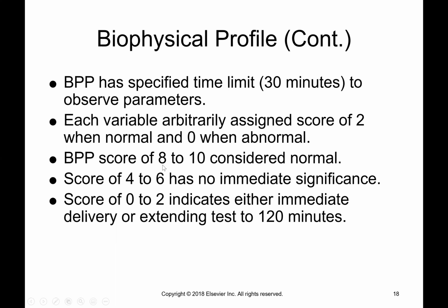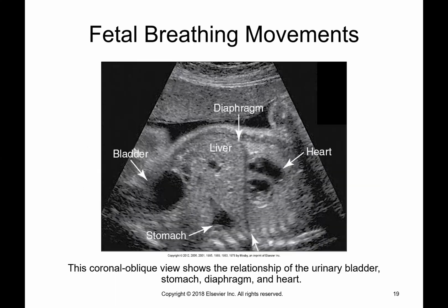of 8. The non-stress test is performed at labor and delivery, at the birth care center, where a nurse performs that. So we don't do that part, but we do the 4 points: the breathing, the movement, the tone, and the amniotic fluid index. So this is where you're going to look at breathing movement, and I will just attach a YouTube video of the baby practicing breathing, just so you know what that looks like. It's hard to miss. They actually breathe quite a bit, and seeing the fetal breathing is such a good sign.